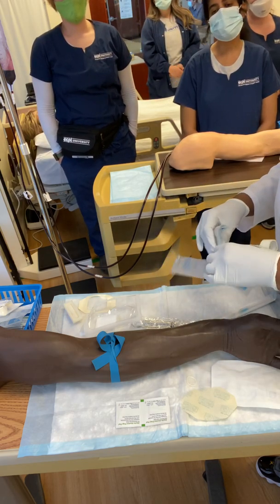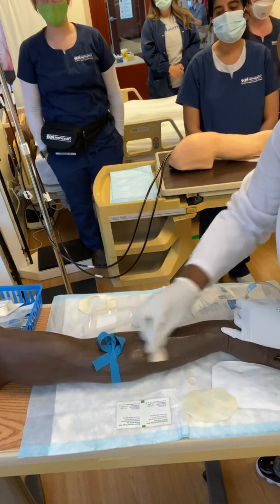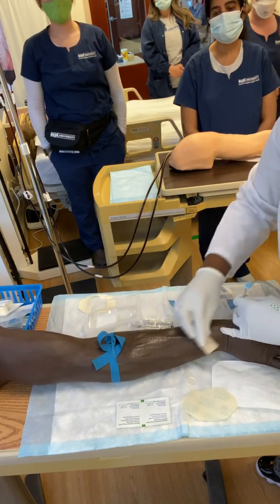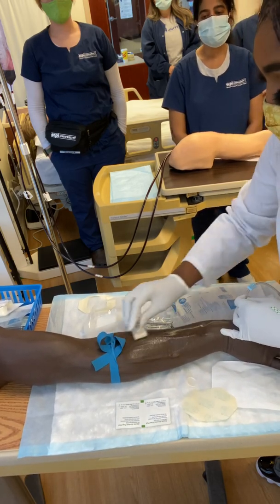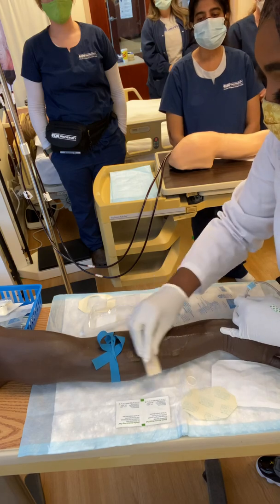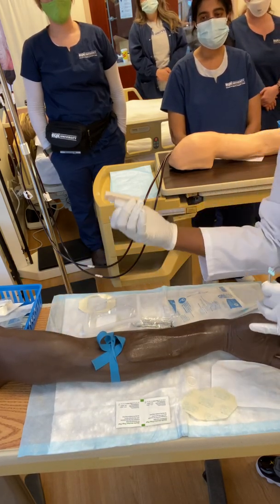And while we have that tourniquet on, let's go ahead and clean our site, because we don't want to have that tourniquet on that long. So we're cleaning it, and you see how we're cleaning in concentric circles around. So you go in and you go around, okay? All right, so we're done with that.